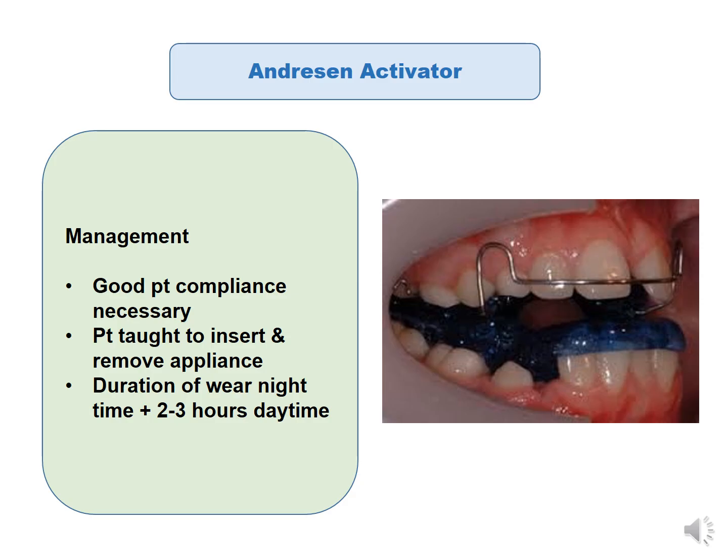Now, good patient compliance is necessary for the success of this appliance. Patients are taught to insert and remove the appliance, and the duration of wear is nighttime plus 2 to 3 hours daytime.